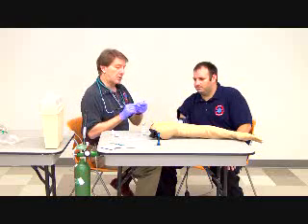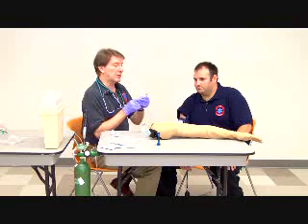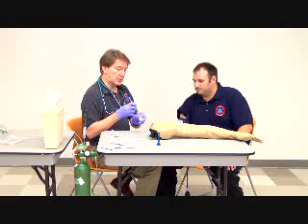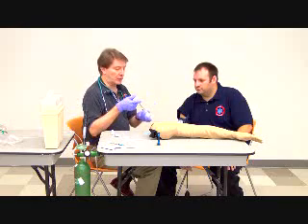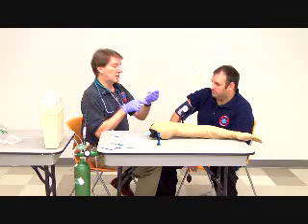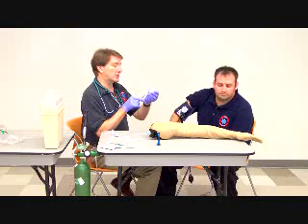I'm going to withdraw a little bit more than 0.3 cc's of air into the syringe. I'm going to pull it up to 0.4, that's arbitrary. I'm then going to pierce the vial, going only at the point where I have prepped, inject my air, and then withdraw to 0.4. This gives you a little bit more epinephrine so that you can get rid of the bubbles and get down to the correct dosage.